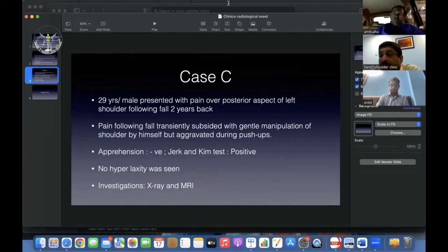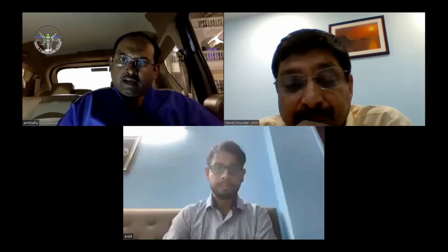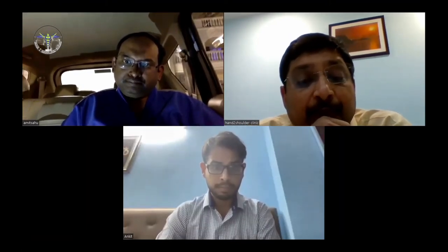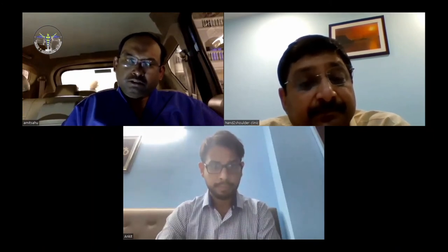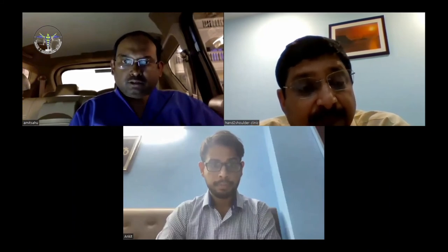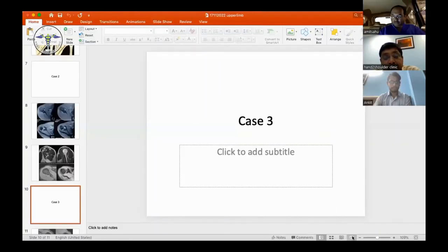Okay. So if there is a Kim test positive, there is a very high likelihood that it is a posterior instability, right? Posterior impingement or posterior instability? Yeah, posterior instability. Okay, so I'll show you the MR images, which were done in our hospital itself.